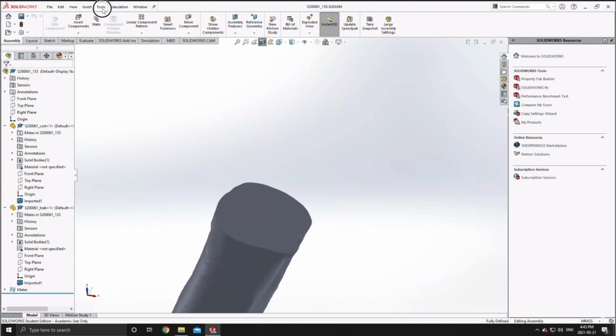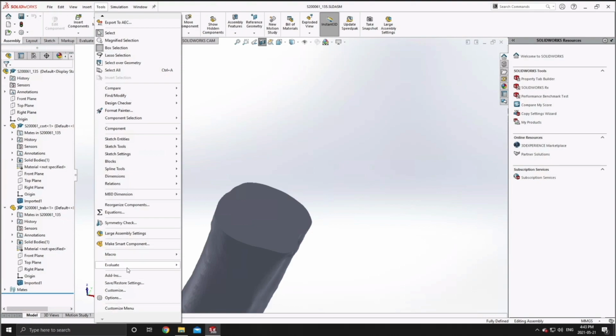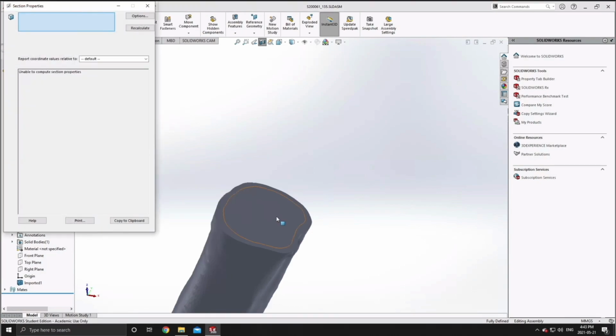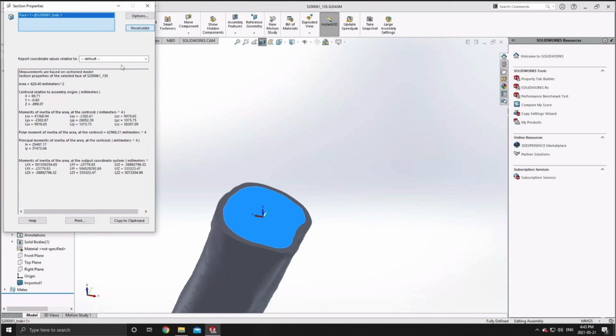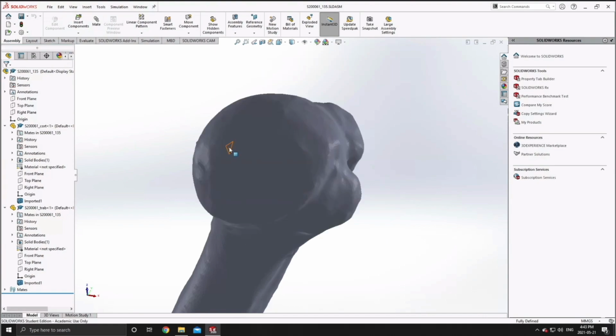Now, in order to perform these analytically, we're going to be using the SolidWorks Evaluate tool, which is under Tools, and we're going to be looking at the section properties, calculating the centroids relative to the assembly origin, and just make sure that you note down these values, as we'll be using them to position points later that will be used to create a central axis along the diaphysis.